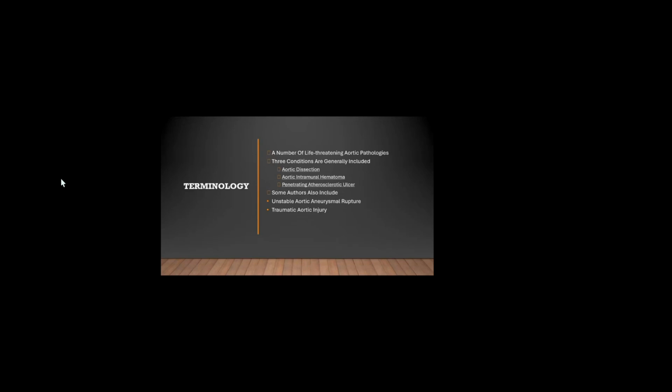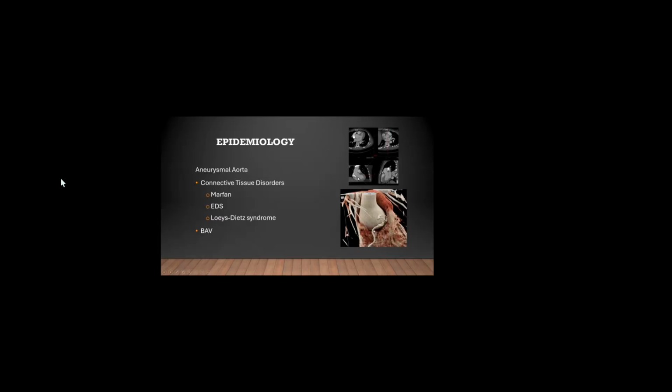I'll also cover, in brief, some of the techniques in CT, when to request this protocol and when to avoid that protocol, and some hints about the crucial differential diagnosis of acute aortic syndromes. Possibly there won't be time to cover the other entities, so I'll go through the three major entities that are frequently encountered in the radiology suites.